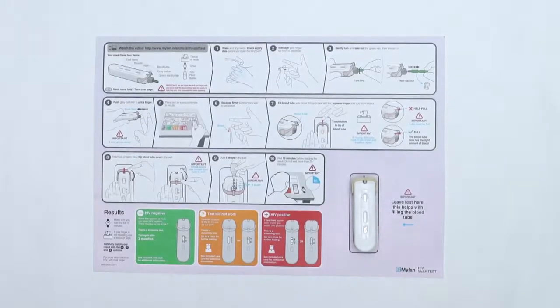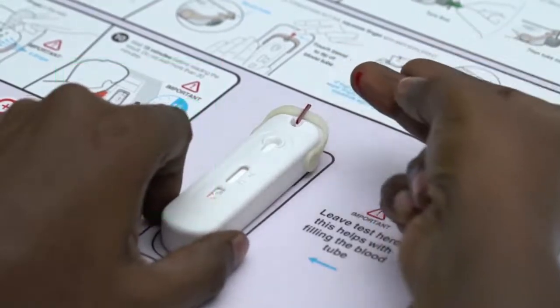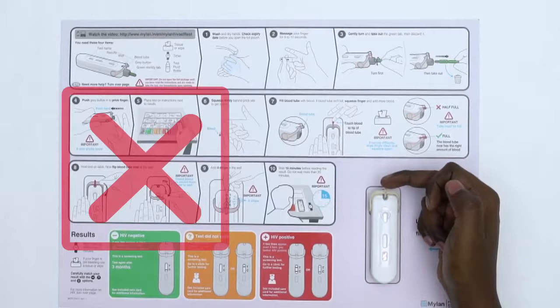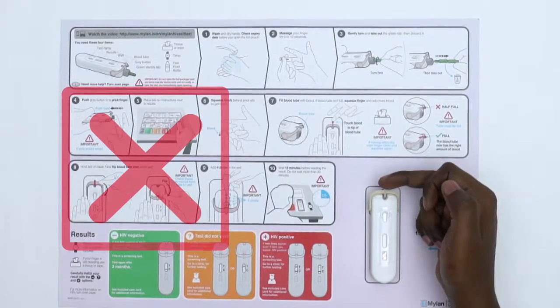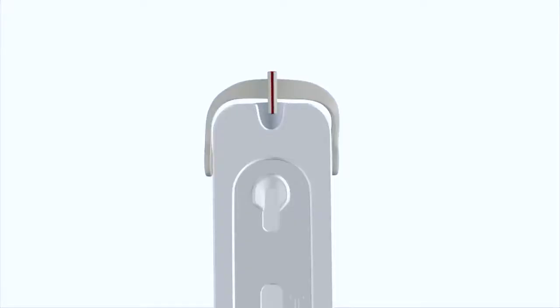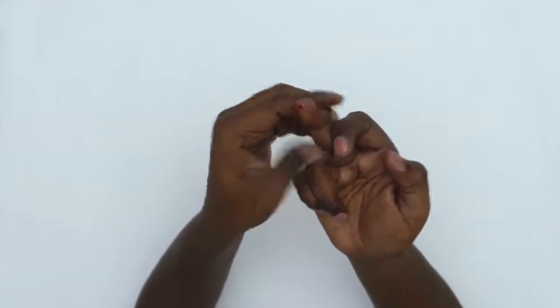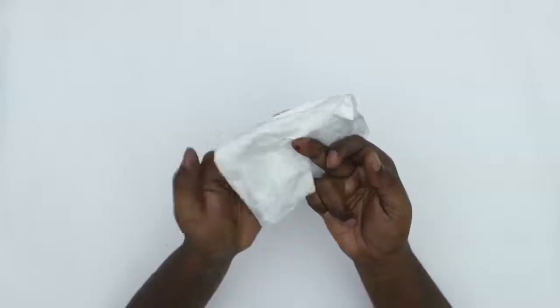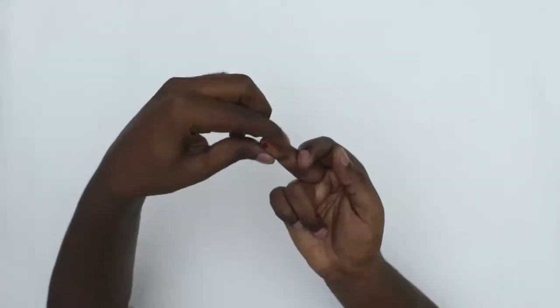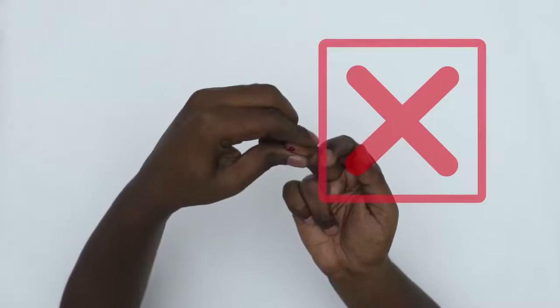Hold your finger in a downward position and gently touch the blood to the tip of the tube so that the tube fills with blood. Avoid touching the tube with your skin. Do not force blood into the tube — if there is enough blood on your finger, the blood will be drawn into the tube automatically. If the tube is not full, squeeze your finger again behind the prick site. If you are having trouble filling the tube or blood has smeared on your finger, take a moment and wipe your finger clean. Don't pinch your finger in front or to the side of the prick site as this will reduce blood flow.